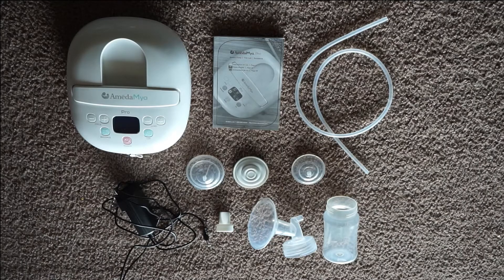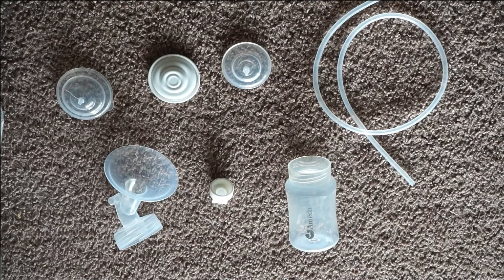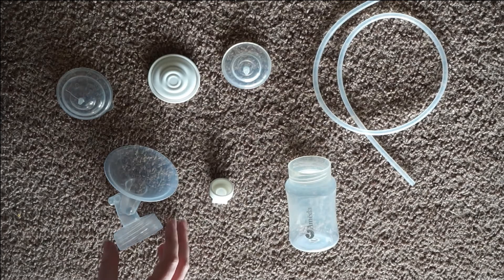Now I'm going to go ahead and show you guys how to assemble your parts. The bottles do come with lids as well, but I don't use mine to store milk — I just use them to collect milk, so I have mine put away right now. Here's a look at everything. I would say start off with the easiest thing first.